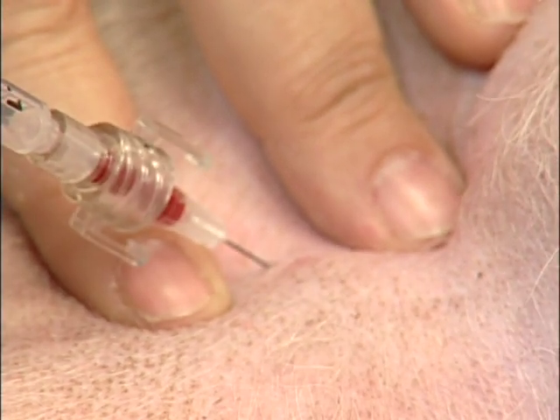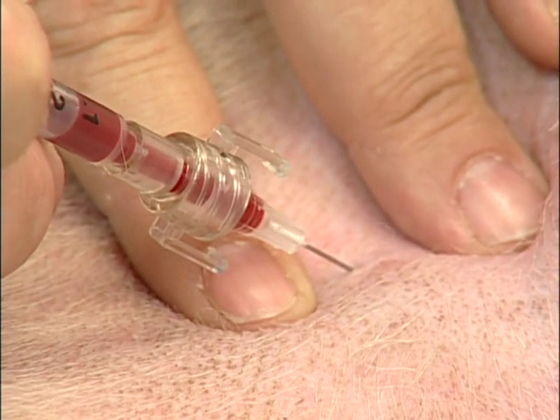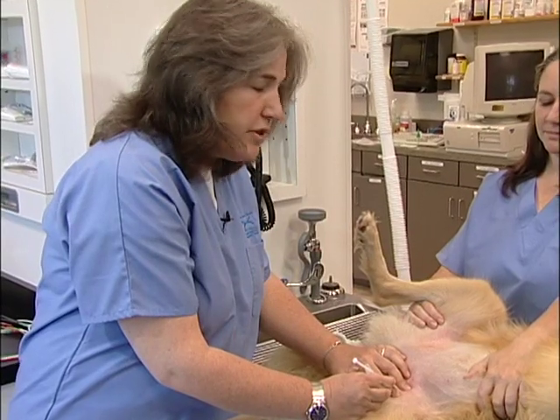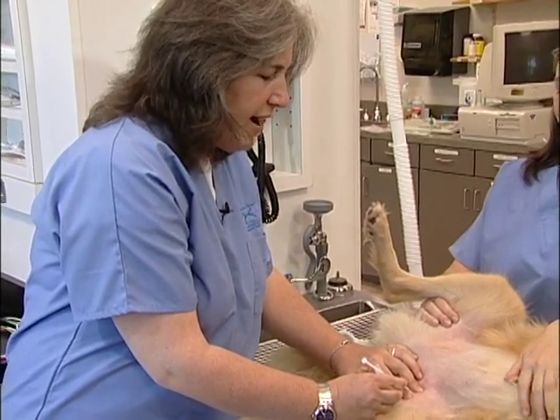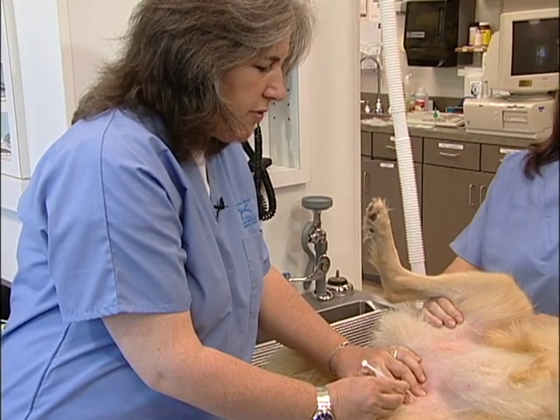You can see the blood as it comes back into the syringe and fills quite easily. I have the syringe preset to 0.5 cc's and I'll wait until the blood actually fills the syringe to that level.